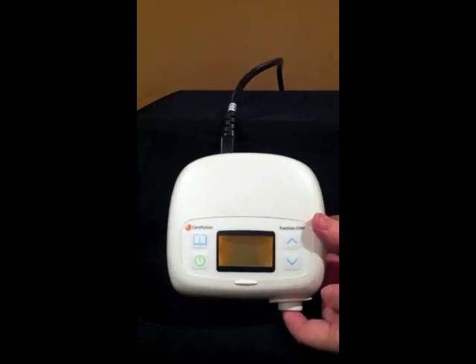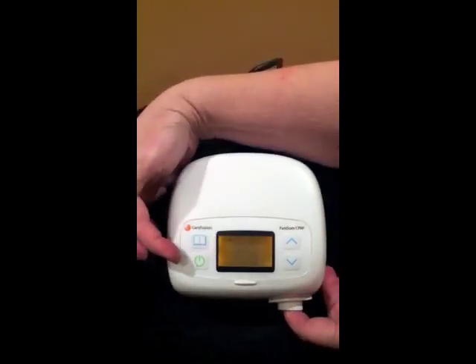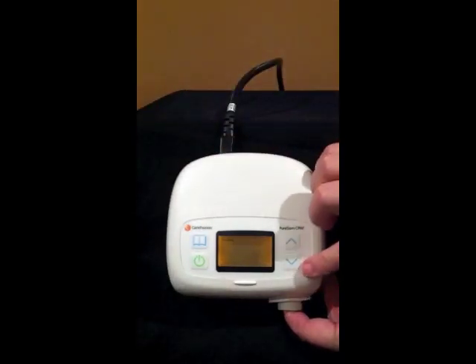Setting your PureSOM CPAP unit. On the front you will find your standby on/off button, menu button, and scroll up and down button.